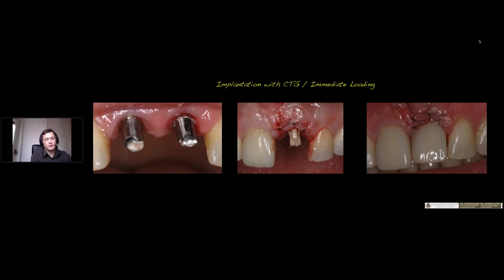because we want to have an abutment with the outside of zirconia. Because if you make zirconia a little bit rough, up to 20 up to 40 microns, you're getting much better soft tissue stability between the soft tissue and the abutment. If you're using titanium abutments, the color of the titanium is a little bit darker, so the shape of the soft tissue is not the same. And on the other side, the stability between the soft tissue and the abutment is not the same.